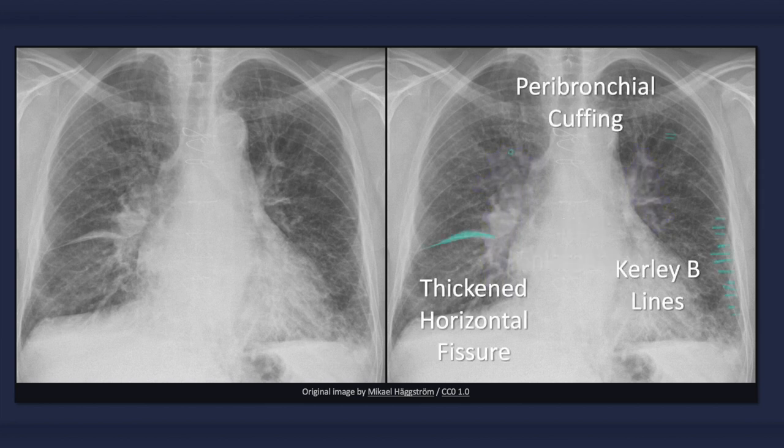An edematous interstitium is another important feature of congestive heart failure. Three signs of thickened interstitial tissue include Kerley B-lines, peribronchial cuffing, and interlobar fissure thickening.